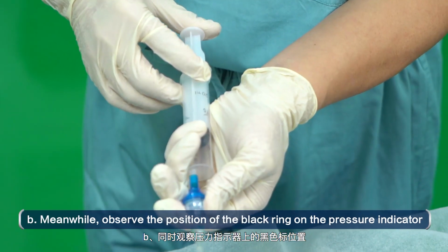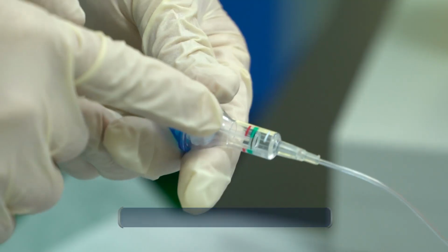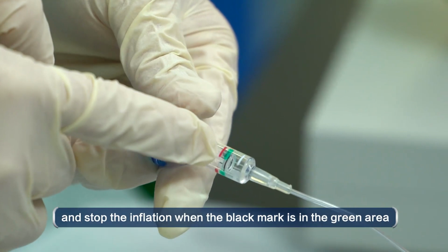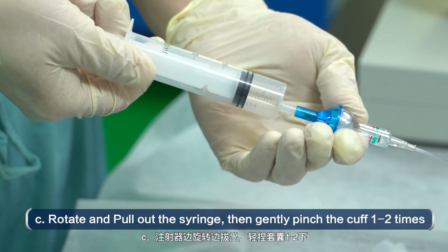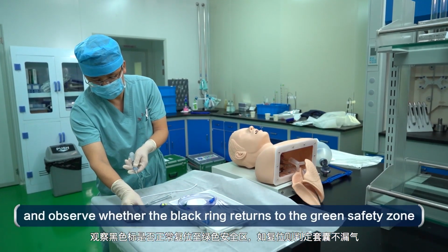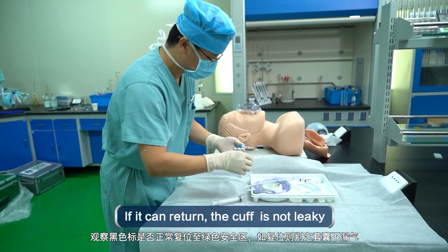B. Meanwhile, observe the position of the black ring on the pressure indicator and stop the inflation when the black mark is in the green area. C. Rotate and pull out the syringe, then gently pinch the cuff 1 to 2 times, and observe whether the black ring returns to the green safety zone. If it can return, the cuff is not leaking.